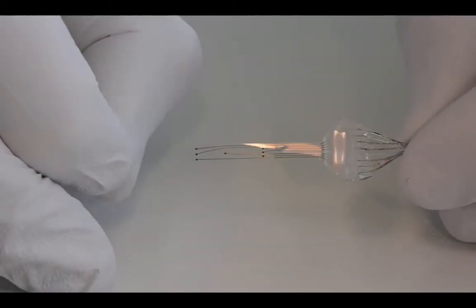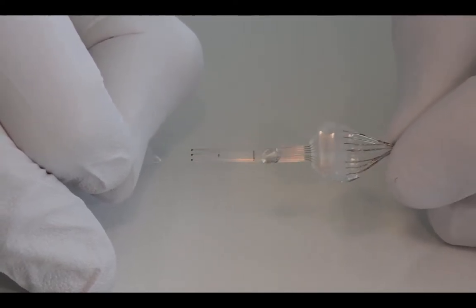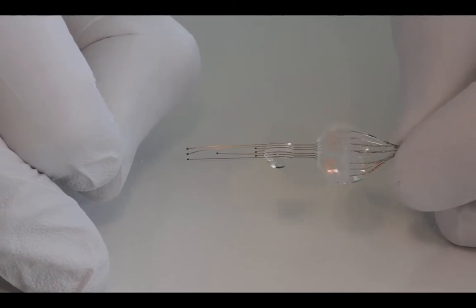The implant combines multiple electrodes and a chemotrode, which consists of an integrated microfluidic channel that delivers drugs directly to neural tissue.